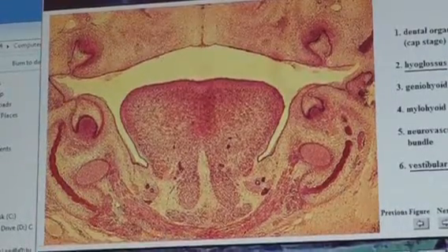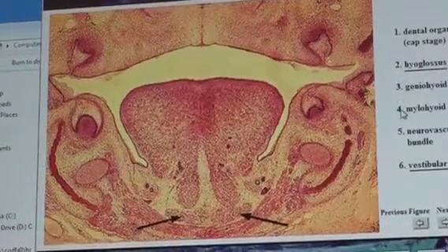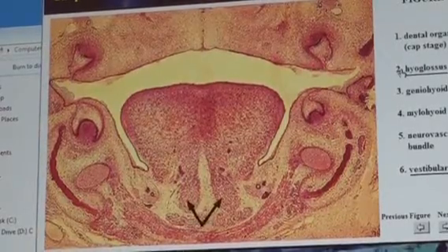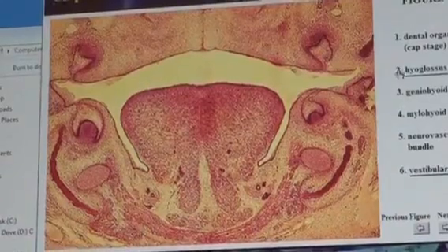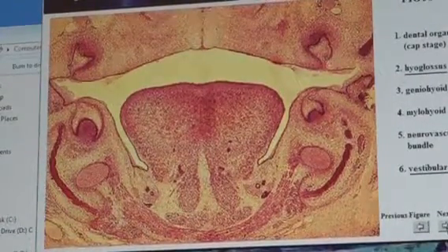And we see some of the muscles Dr. Harn's going to talk about. There's the geniohyoid, we have the mylohyoid, and there's the hyoglossus. And later on at the end of the semester, there's a limerick that includes the hyoglossus in it that I'll tell you about.